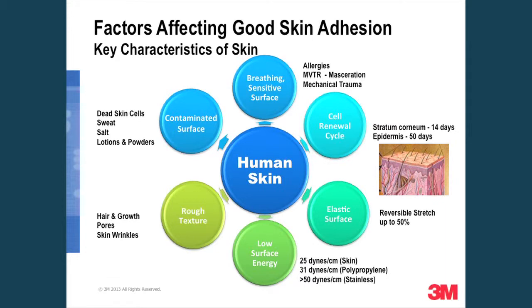Human skin can be a very difficult surface to stick to. I think that's why there's only a few companies that make adhesives that stick to skin or work well on skin. It is, I'd say, a contaminated surface, but that's natural contamination like sweat, dead skin cells, lotions and powders that people may use, which can cause difficulties when trying to attach to the skin. Then you have a breathing, sensitive surface. Nothing quite like skin to try and stick to. There's no good test surface for it.